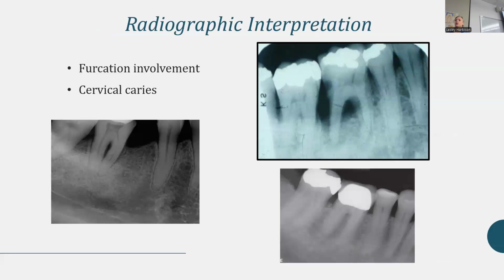So here's just more examples of furcation involvement. Can you guys see the furcation involvement on this tooth with the crown? It's probably impossible to see it on the projector, but if you see it on your computer, it's just barely starting to show radiolucency right there at the start of the furcation. And then obviously these are wide open, so they're way easier.